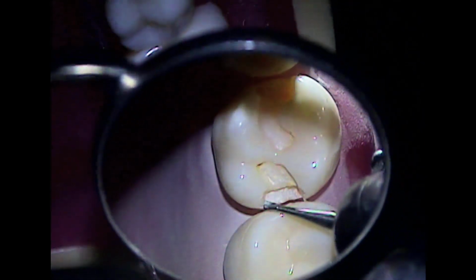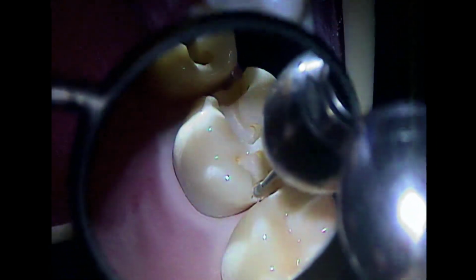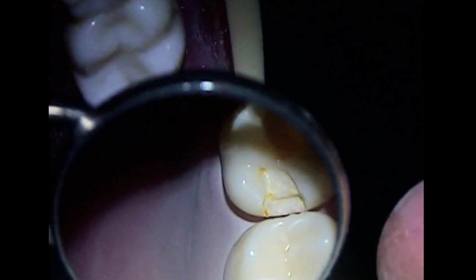Okay. And when you find a margin and you cut an angle, cut farther in so that it goes beyond where you want the axial. I like where you put the axial, but you want to go past it more before you try to make the axial. Go past where you want the axial to be. A little more. A longer, straighter wall coming in. Then you can find the corner right there.